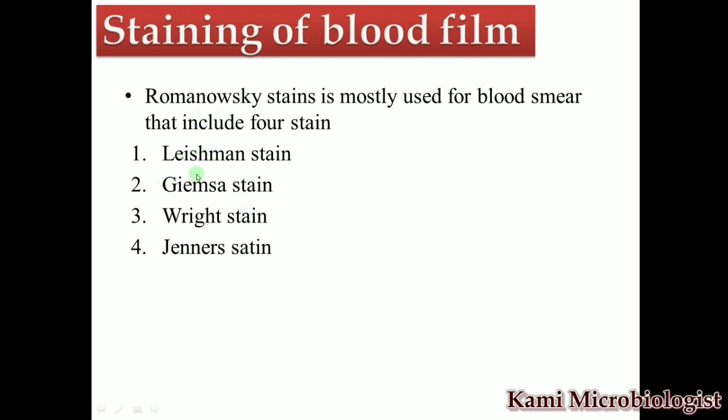Among these, Leishman and Giemsa are really important and are used on a daily basis for special staining techniques. So that's why these two stains are really important.